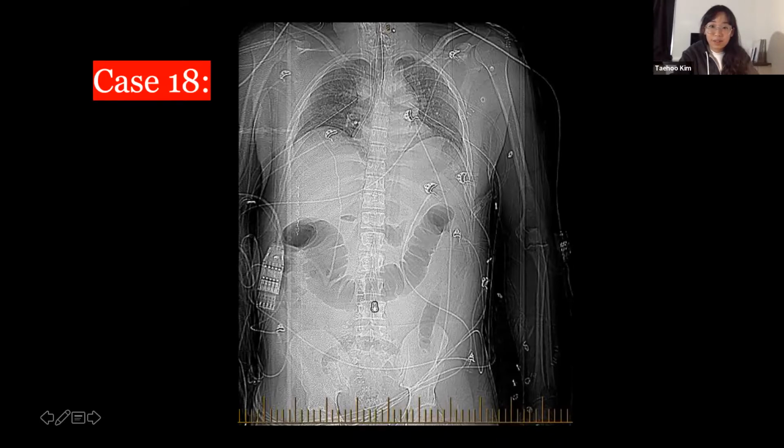What's the preferred time for CT? Oh yeah, pancreatitis. So you can ask for rule out pancreatitis the moment the patient presents. That's the usual practice here at the MUHC and at the Jewish General. But what the guideline says is that you treat clinically, you don't need imaging. The only time you need CT imaging is to look for complications of pancreatitis. So 48 hours later, that's when you see necrosis, pseudocyst, or vascular complications like pseudoaneurysm or thrombosis.